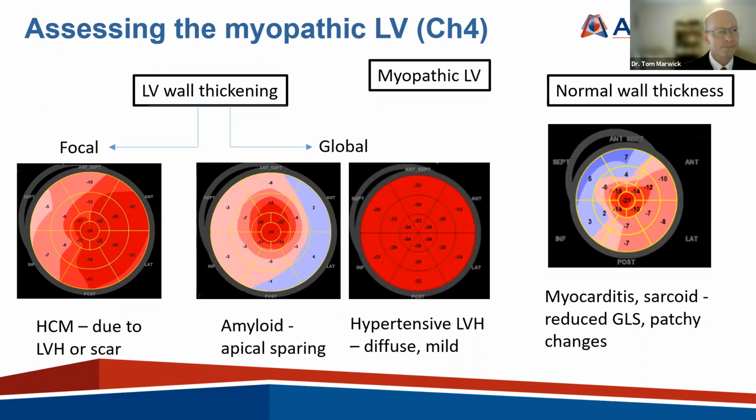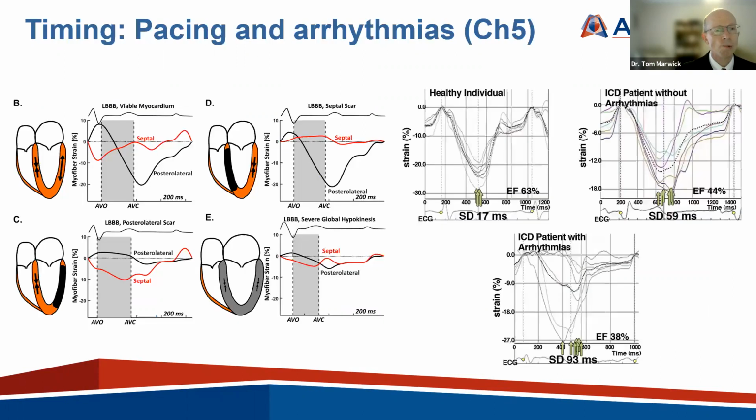slide, please, Christine. The next slide is about pacing and arrhythmias, and the left-hand side of this is about the use in CRT. And I think that the mechanical assessment of dyssynchrony has been very problematic for us, and I'm not sure that the problem has really been solved. But unequivocally, we still have an issue with probably 30 to 40%, or in some cases even more, of people that have a CRT apparently being non-responders.